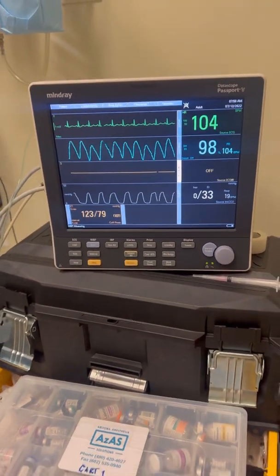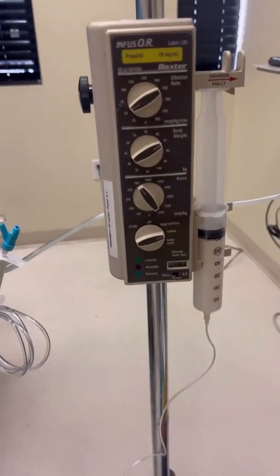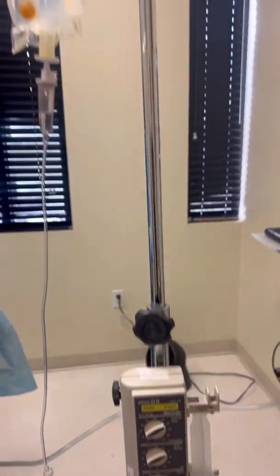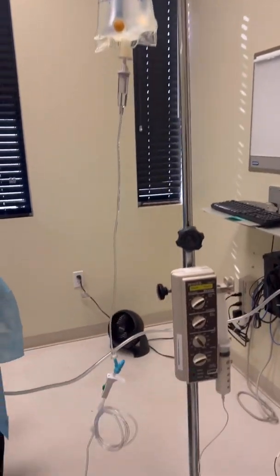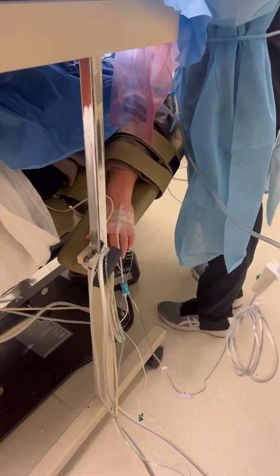I've been getting a lot of questions about my approach, what kind of medications I use, and how I go about these dental procedures. So I'm just showing you here how I start — showing you my setup. I have the propofol pump, my monitor. I like to keep everything organized. You see my wires, keep everything clean off the ground.